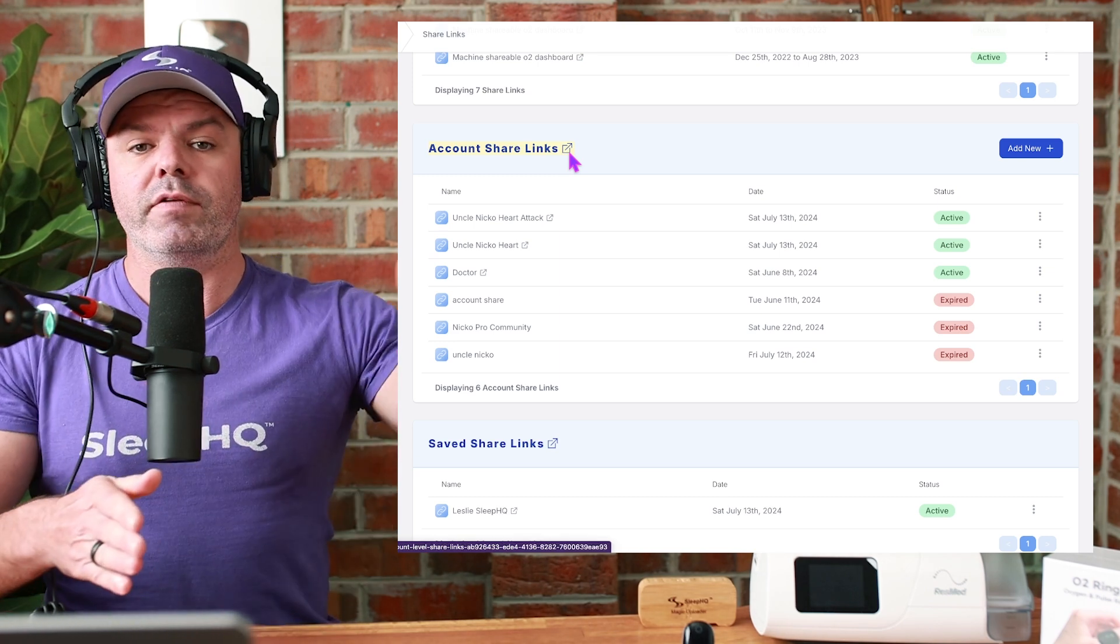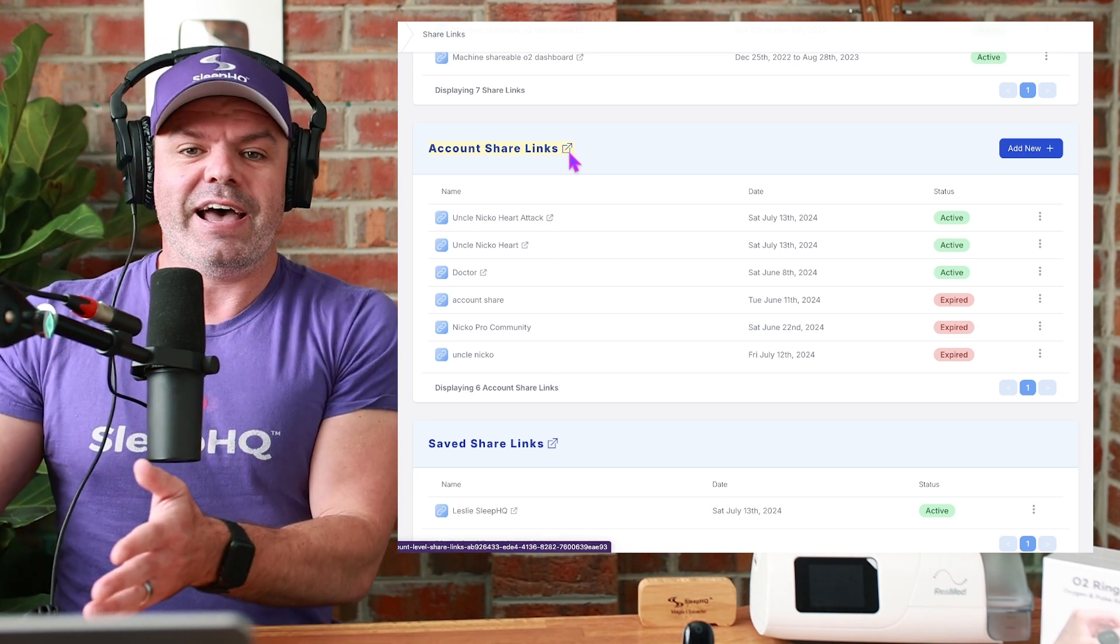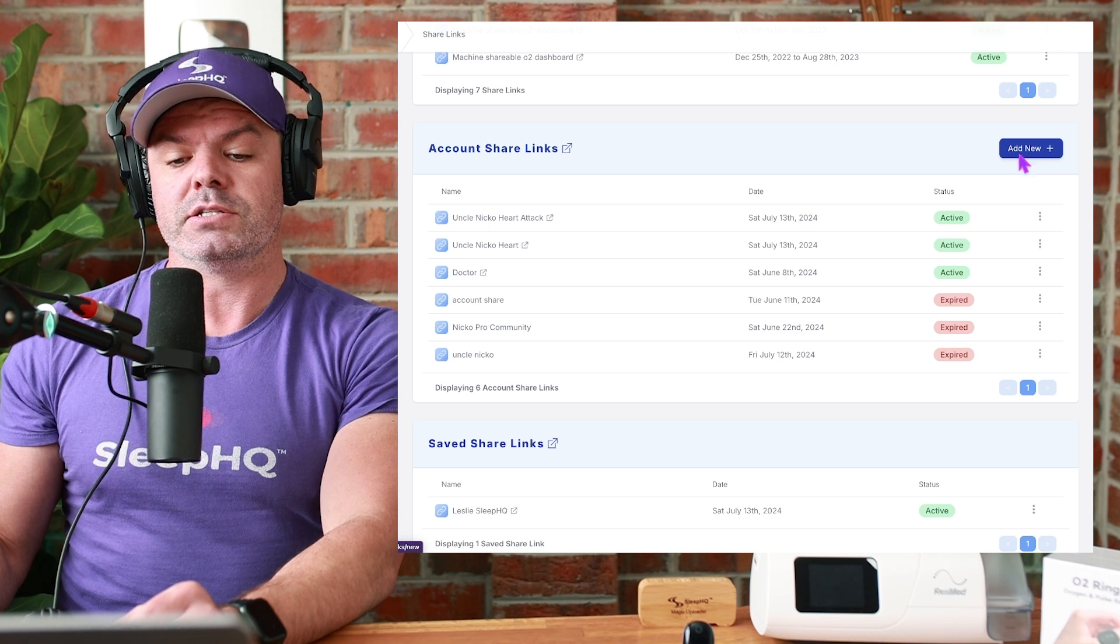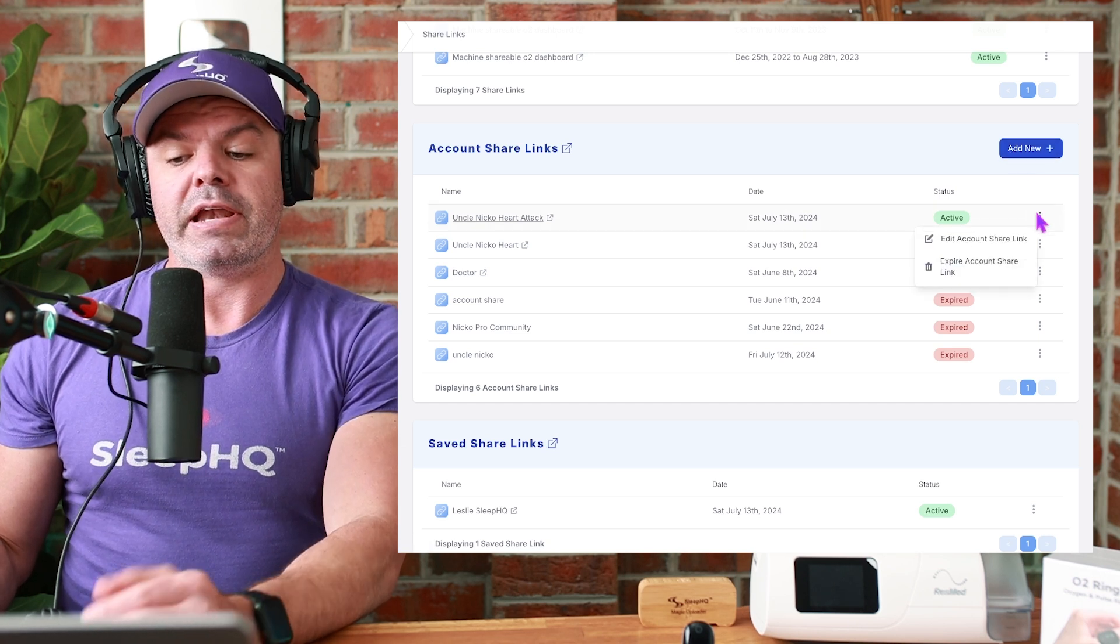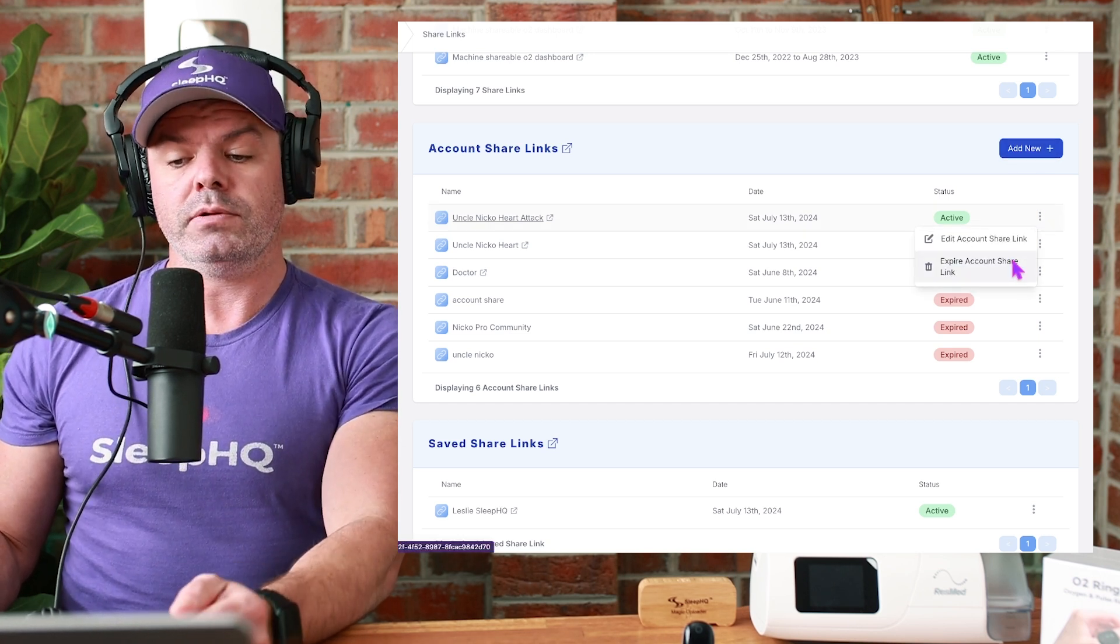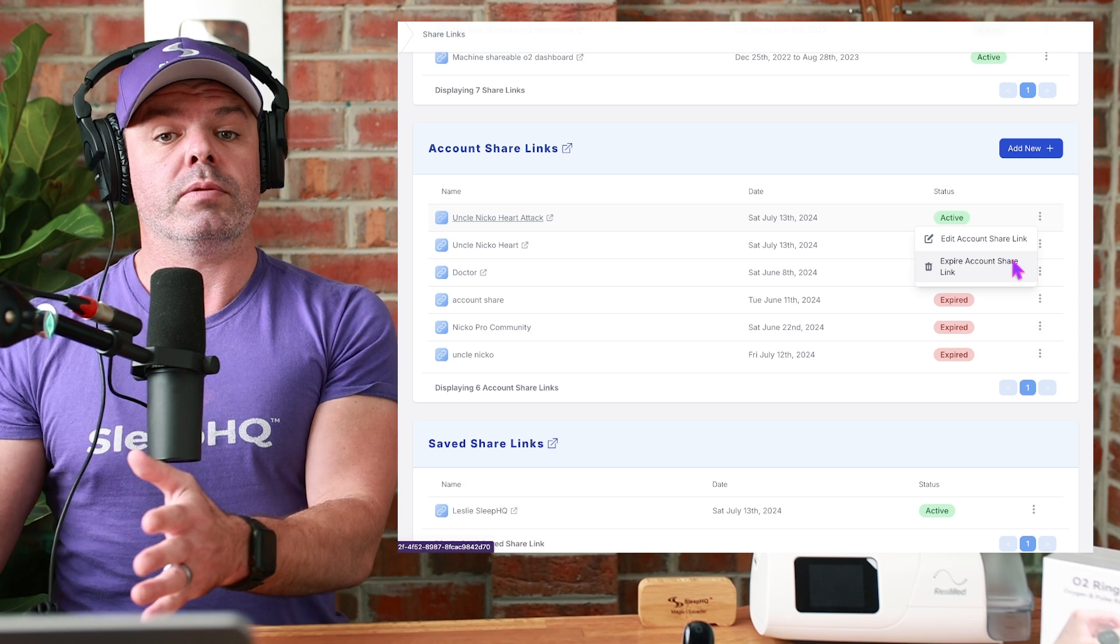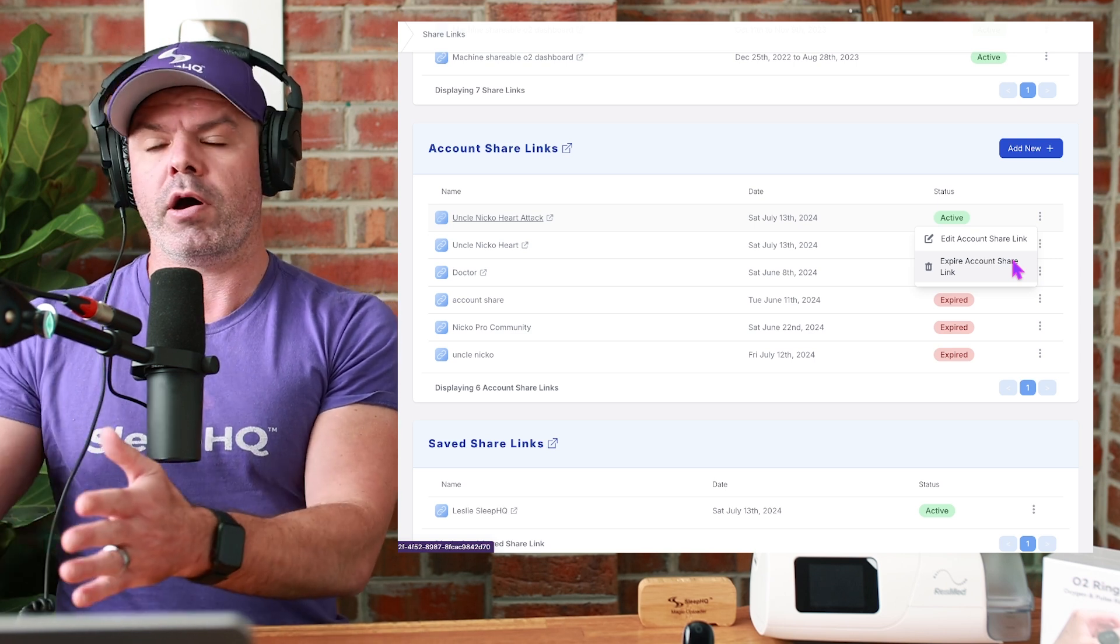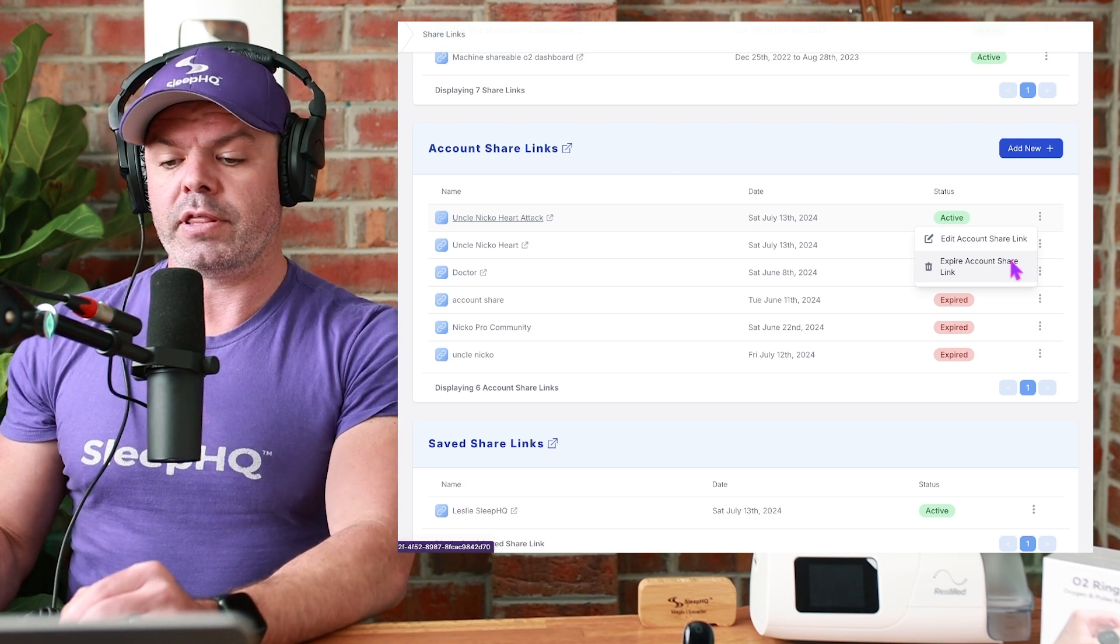You might have one for your doctor, maybe one for your dad, whatever. And you can add new ones straight from here as well. You can rename them and you can expire them as well. And you can also choose when to expire them. I want to expire it a week from now. I'll show you that.